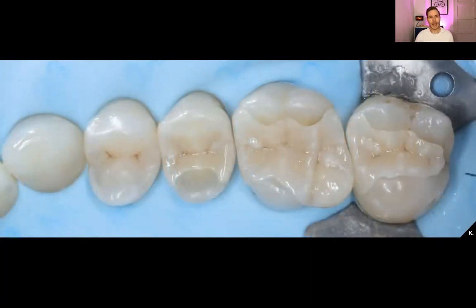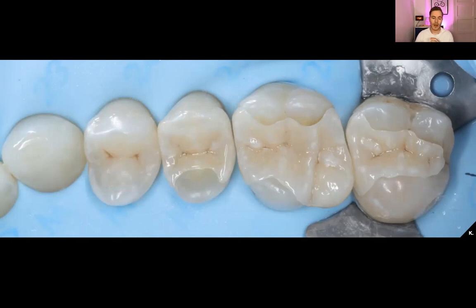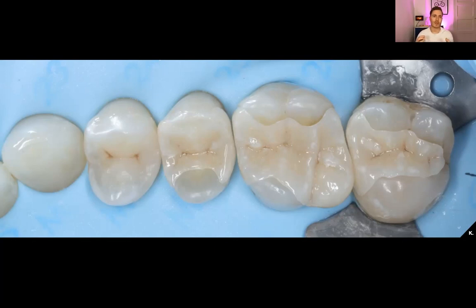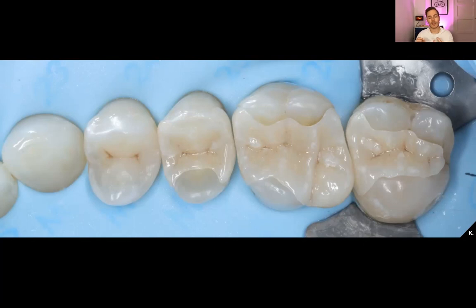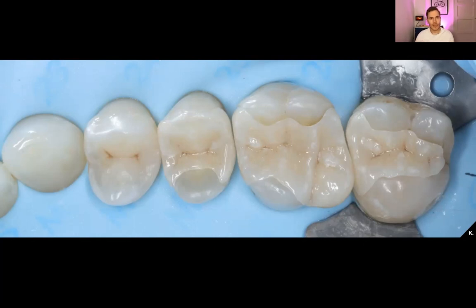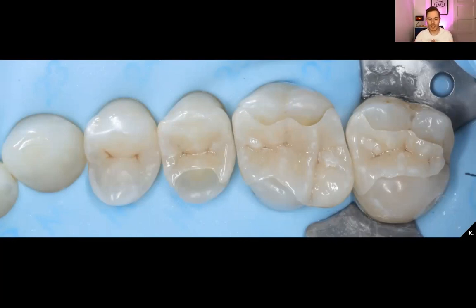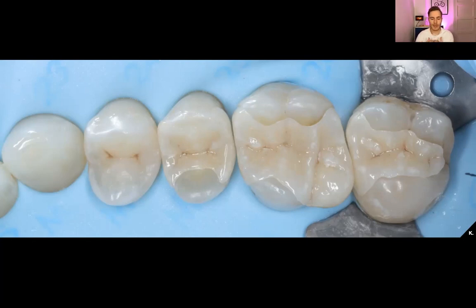I do a dry fit of my restorations — I check them, see how they are, if there are any contact points to worry about. Sometimes the rubber dam can give a little bit of mesial traction and your final restoration won't properly fit. You can sometimes use a wedge to give some counter pressure, but in this case the restorations have a nice fit. Even though it looks like some of the margins are off during the try-in, once you put a little bit of pressure and push them down you will see that the margin is quite good.